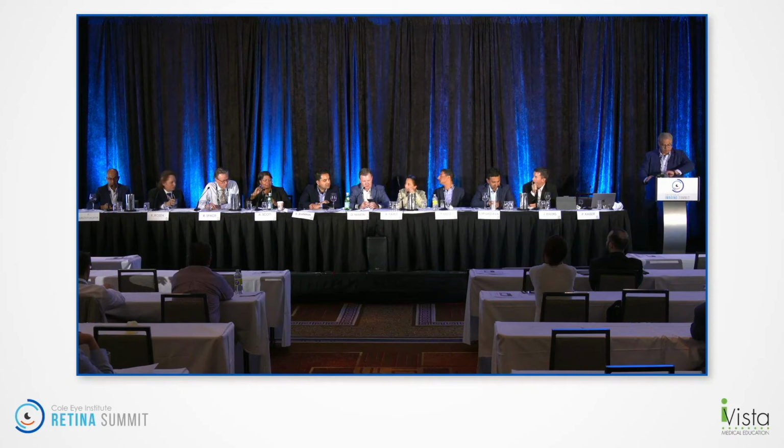Yeah, the second part of the experiment was actually trying to label the image, teaching the algorithm what is an eyelash, what is too dark, what is too bright, what is off-center. So the second part of the algorithm was trying to be more specific about what the artifact was. So we're trying to tell the photographer not only that your picture is not good enough, but also some sort of theory as to why, specifically the artifact.